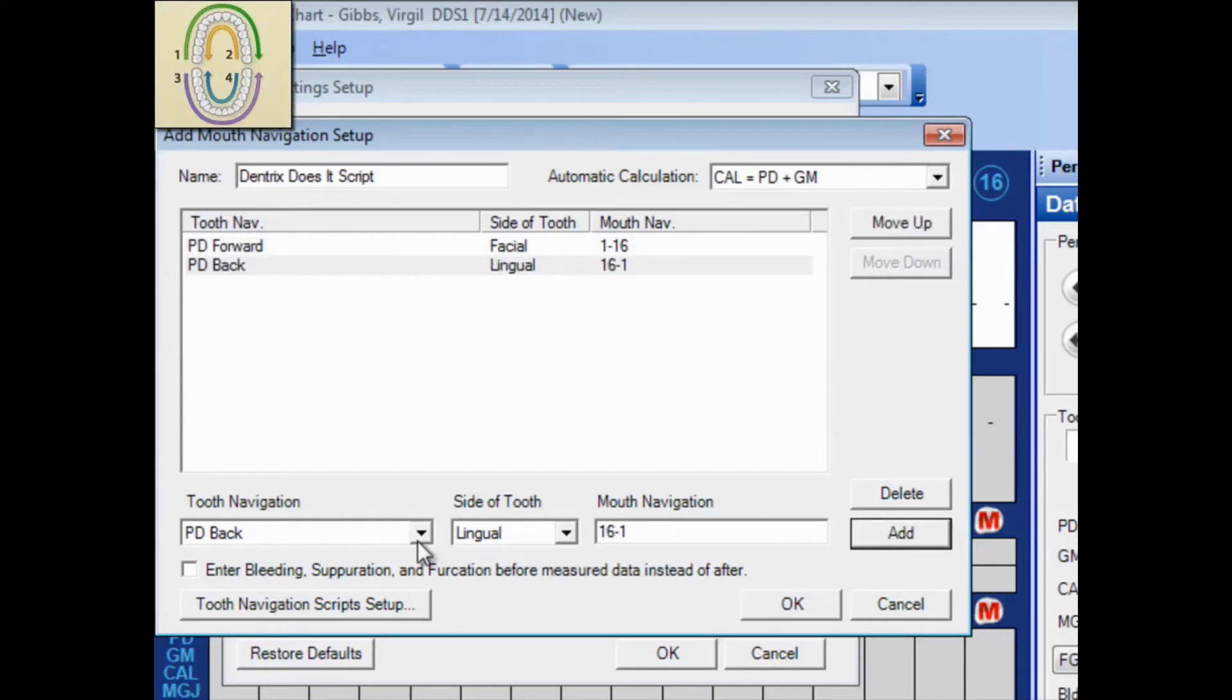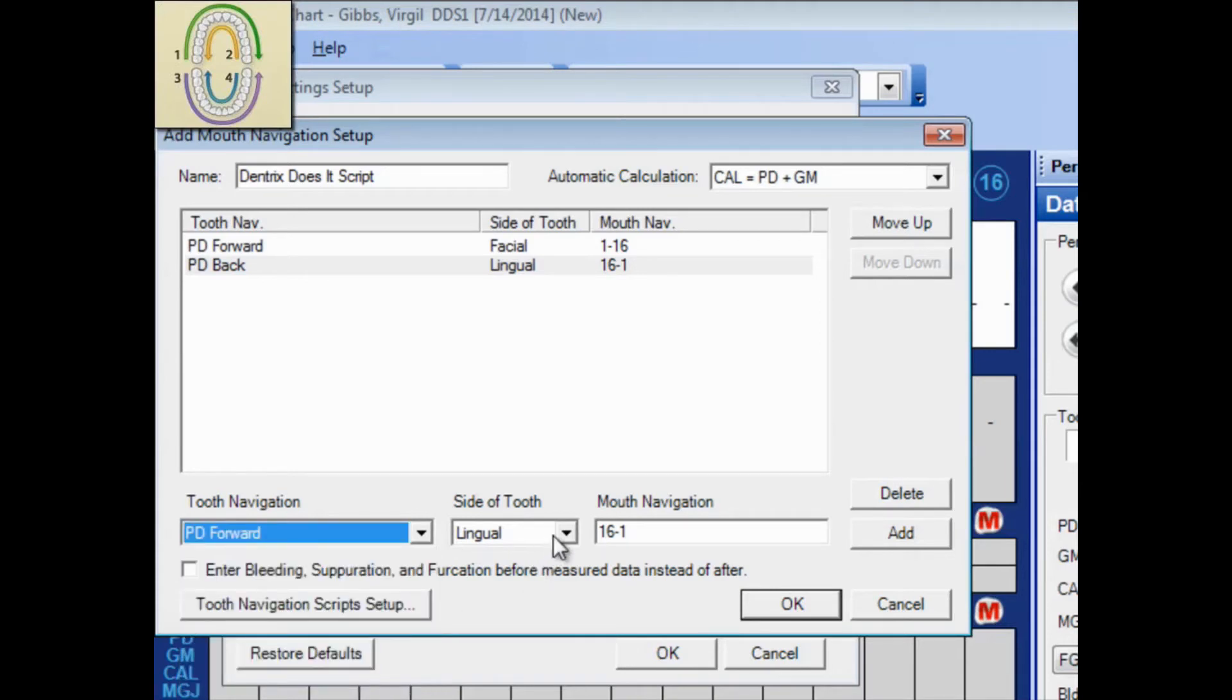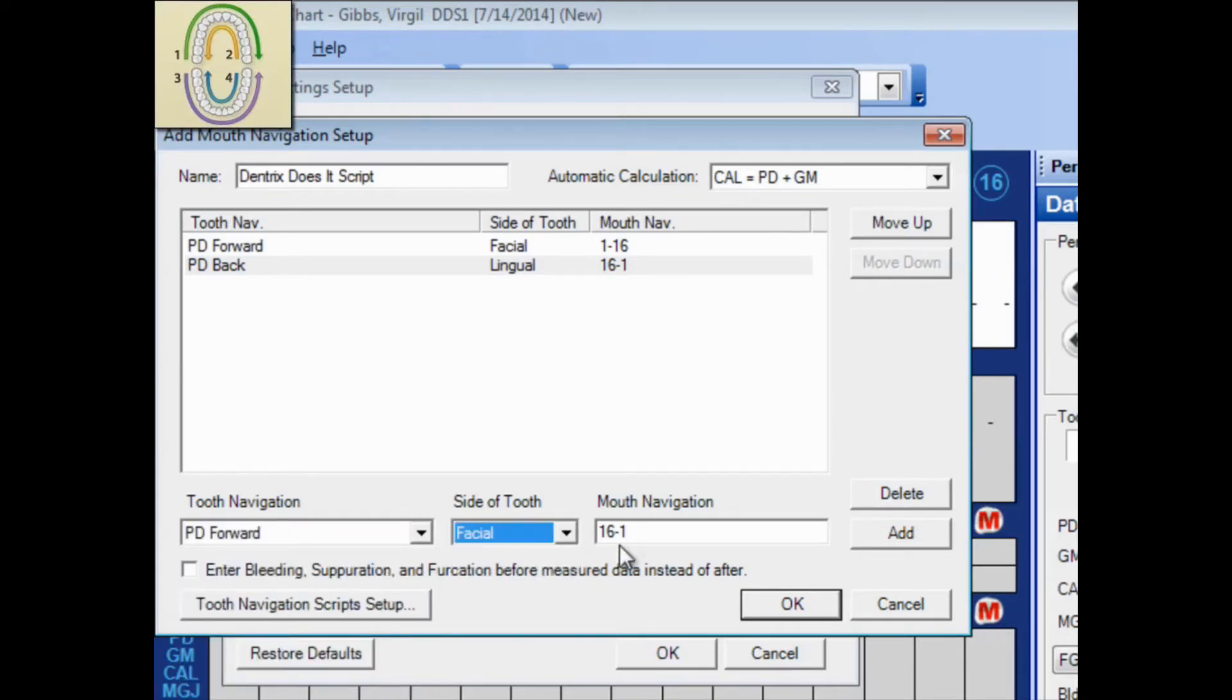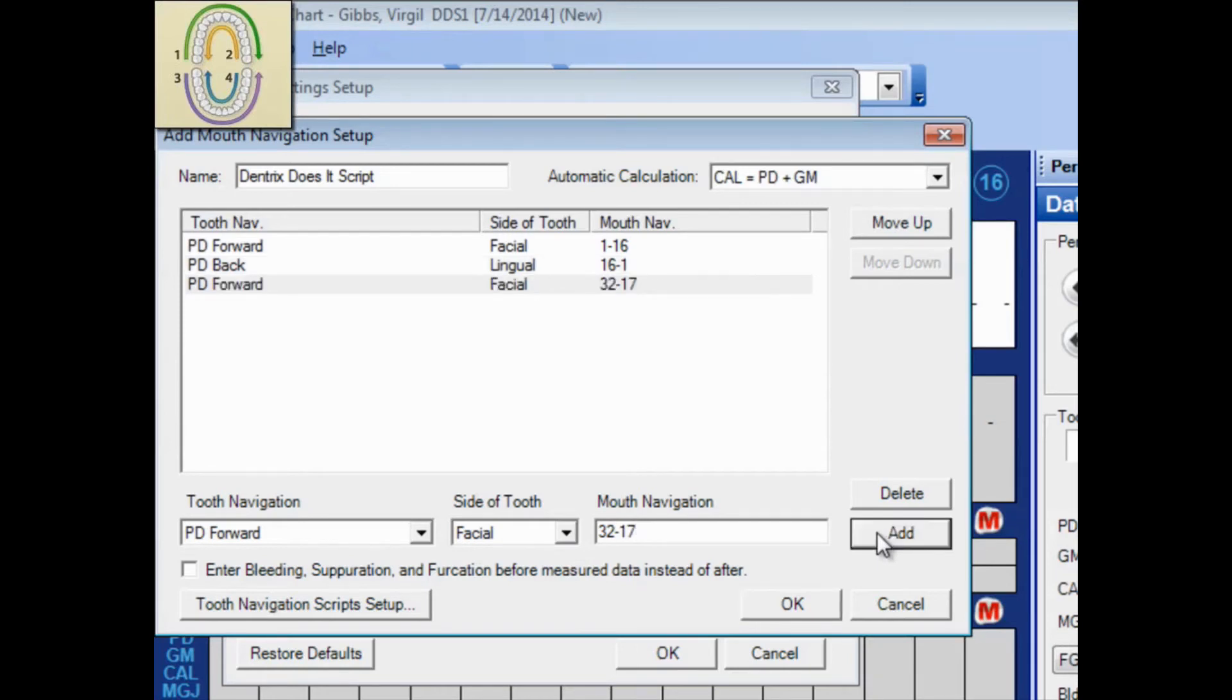The third part of my script is moving in a forward or left to right motion, checking the facial side of the mouth, with tooth 32 through 17, being the probing direction. Click Add.